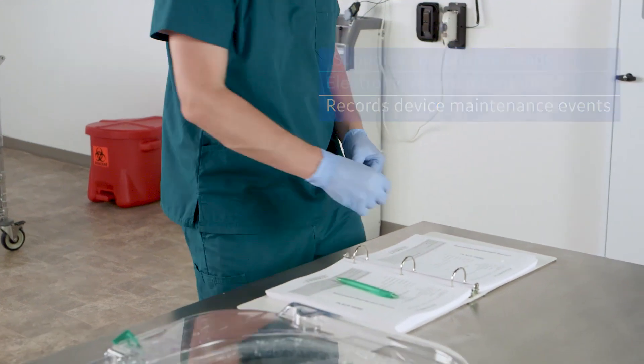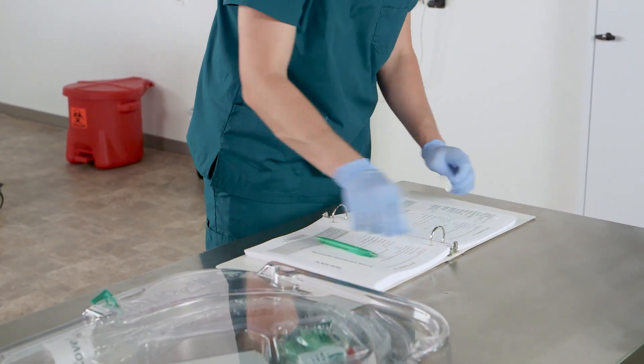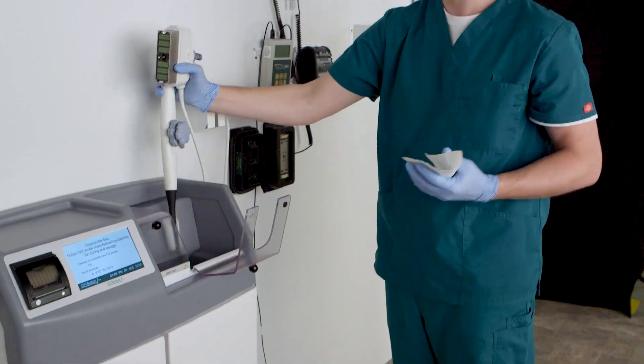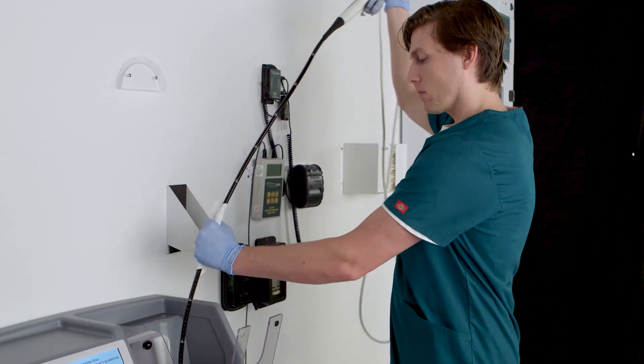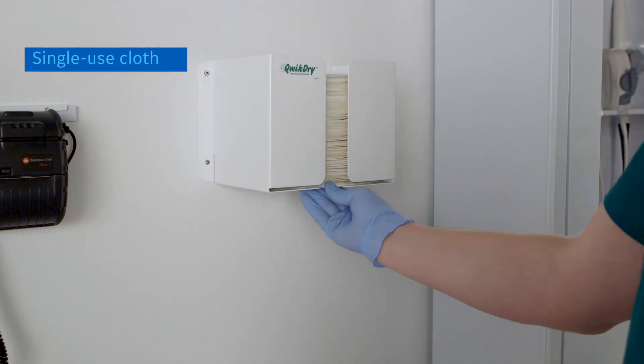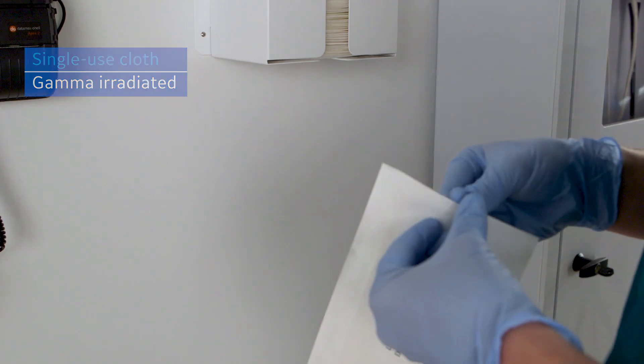This information can be printed on a verification ticket for the hospital's records of a successful cleaning and high-level disinfection. As soon as the probe is removed, it should be dried to prevent recontamination. The quick dry cloth is single-use and gamma-irradiated, which ensures that there is no bacteria or viruses on the cloth.